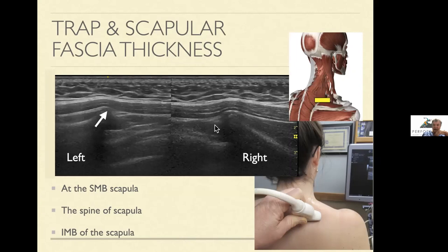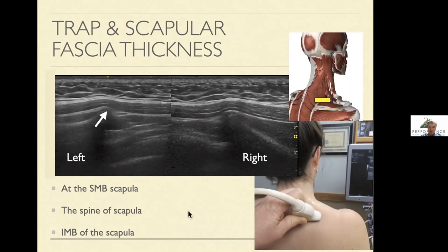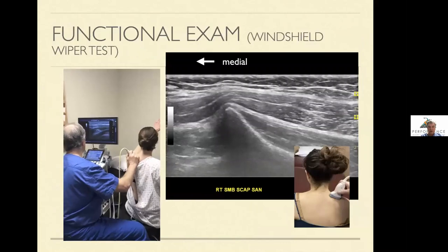Occasionally you'll see a hyperechoic signal that can represent an old tear to that area. Repeat this process at the spine of the scapula and then over the rhomboid, making these measurements. You're scanning first up high for upper trap fibers, at the spine of the scapula for middle trap fibers, and then down here for lower trap fibers, looking for atrophy of those tissue planes.